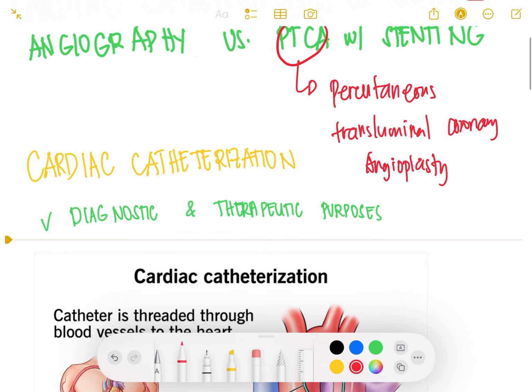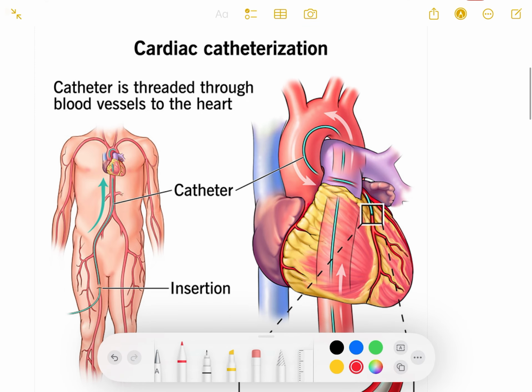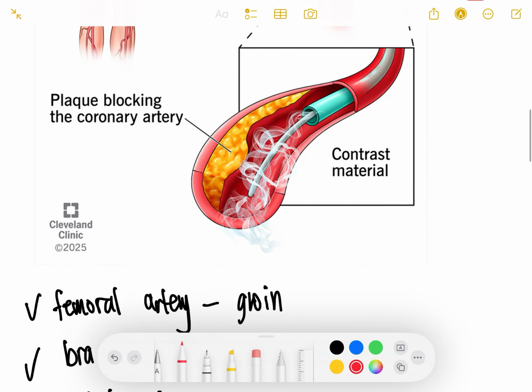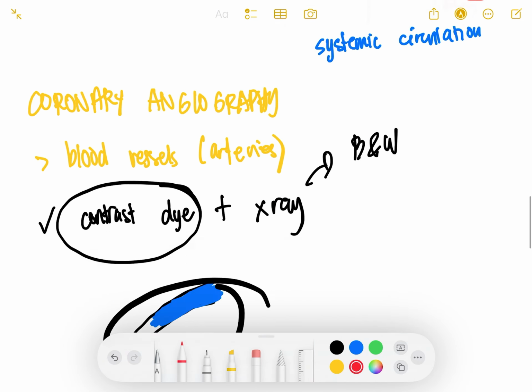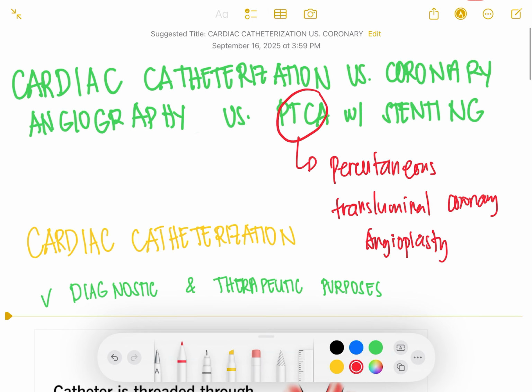So, what happens in your PTCA is, simple lang yan, okay? During cardiac catheterization, pag may nakita na blockage sa artery, for example, ito, si atherosclerosis. Nasaan ba si atherosclerosis? Okay, in the previous discussion, pag merong atherosclerosis, ibig sabihin, pag merong blood vessel na binarahan ng cholesterol or other fatty substances at nakita yan sa cardiac catheterization mo, pwedeng mag-perform ng PTCA. So, what is PTCA? In PTCA, magi-insert ng catheter.